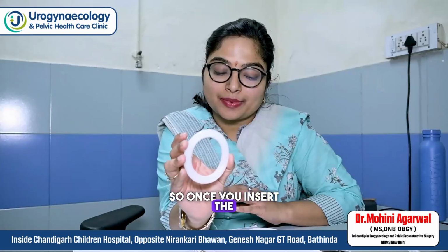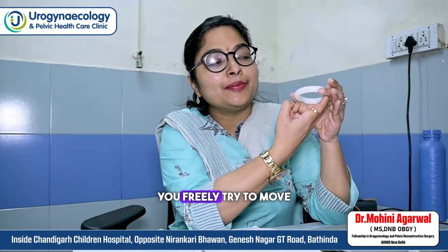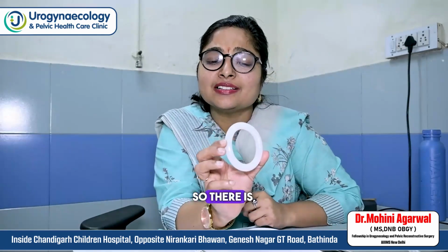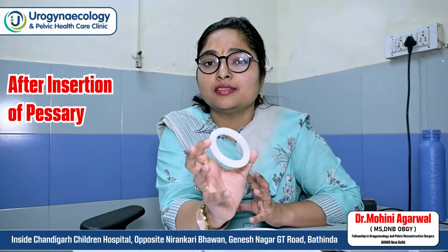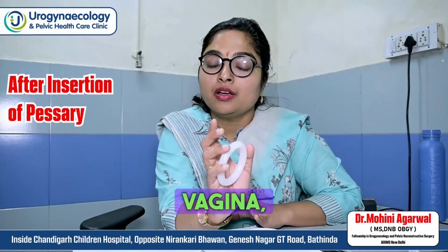Once you have inserted the pessary, you put in your finger; this is the vaginal wall and this is the pessary. You try to move your finger freely around the pessary. It should not be tight. If there is no pressure, sores will not develop. If it is very tight, they will develop. So you ensure that it's not too tight, and you should be able to move your finger freely around the vagina, between the pessary and the vagina.